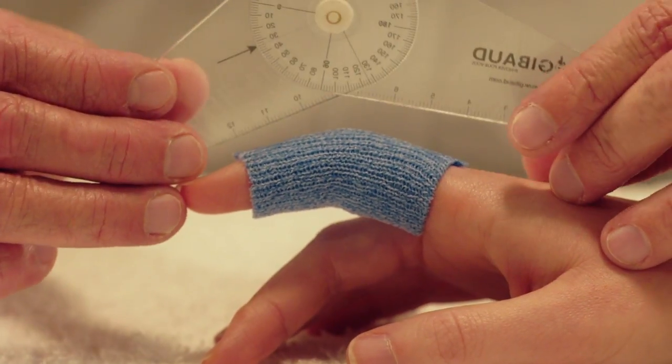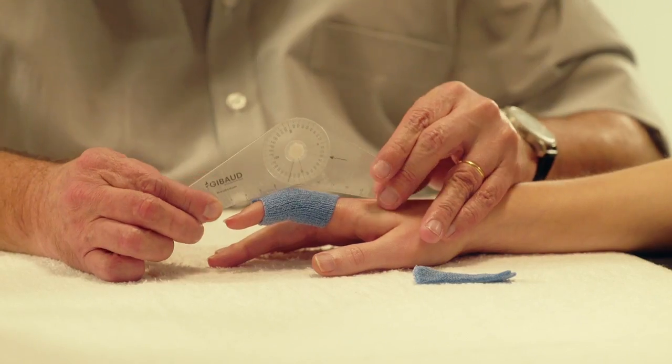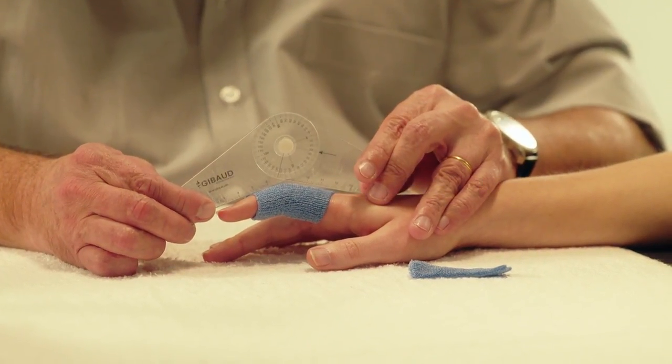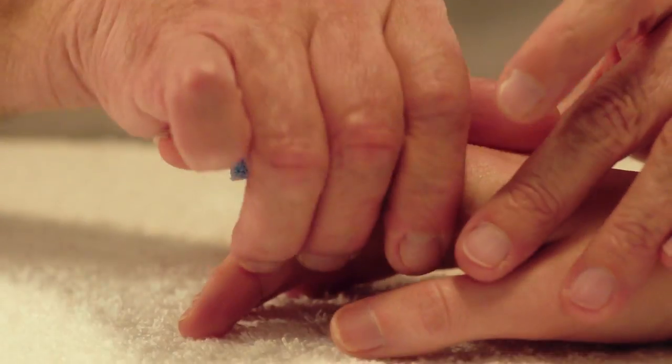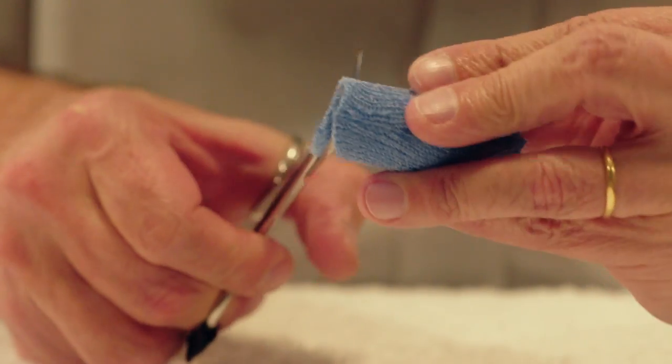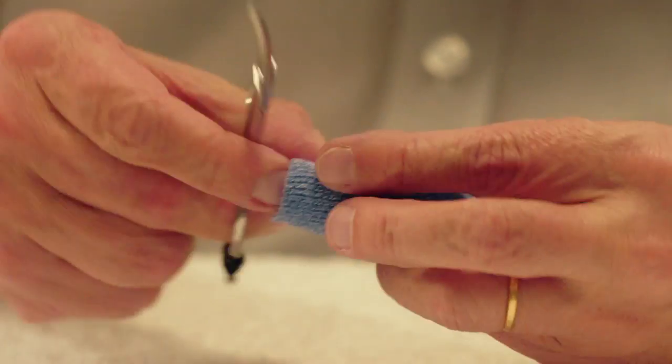Flex the PIP joint of the finger in 30 degrees flexion during hardening time. Verify the correct position of the PIP joint with a goniometer. Remove the orthosis from the patient and trim the volar distal and proximal portions of the orthosis.